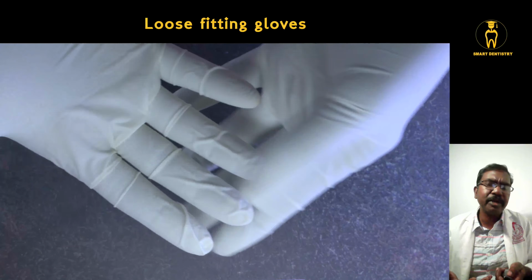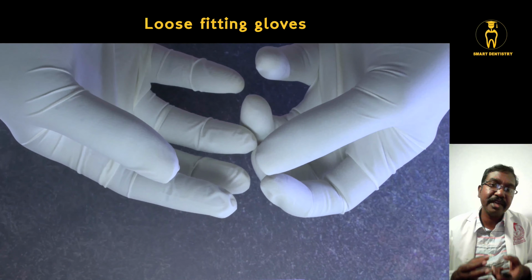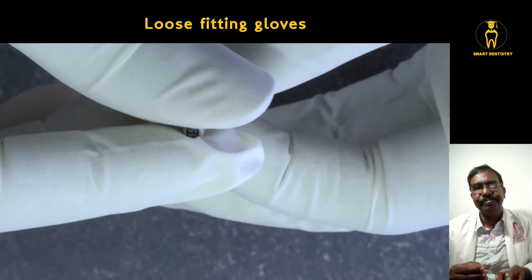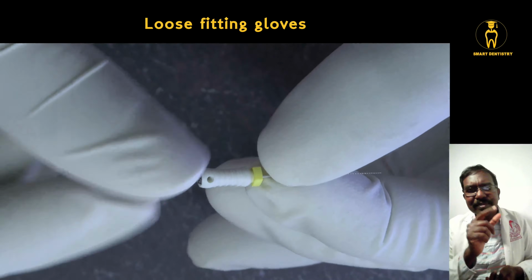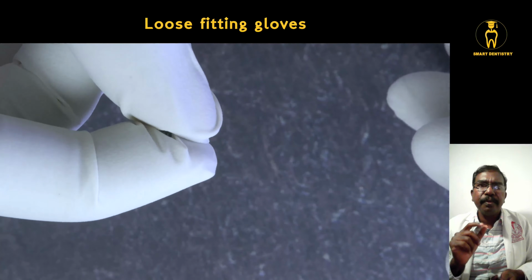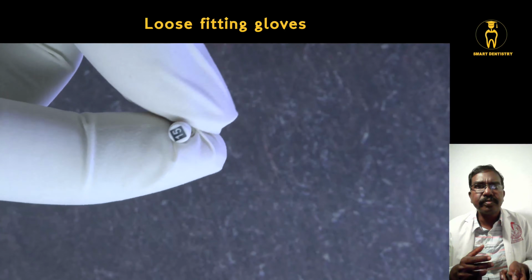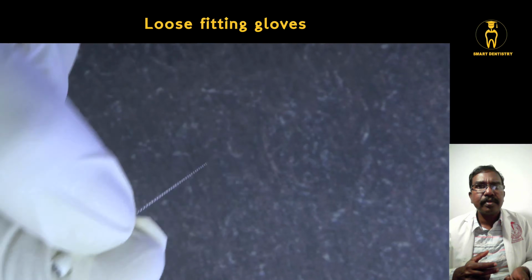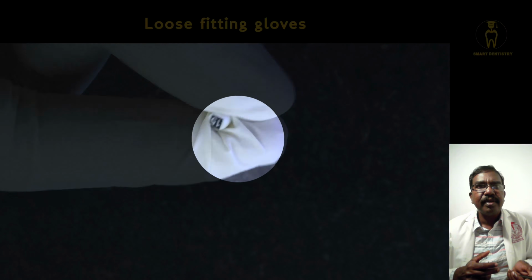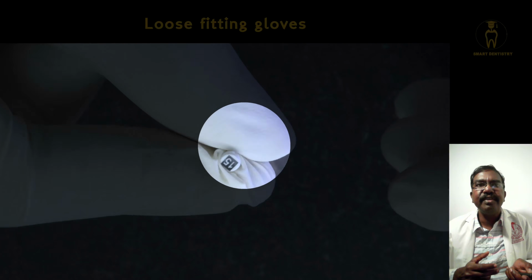The real problem is whenever you are holding a file, for example an endodontic file, and let's say you are doing a watch winding motion. Okay, so what will happen is, let's see that. Let's watch the video, and once you are holding it and trying to do a watch winding, the glove will get entangled within the file.